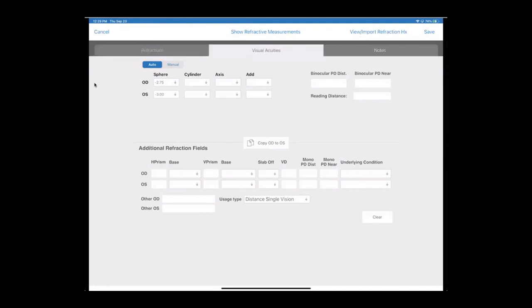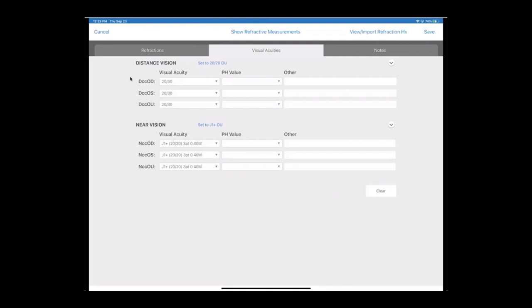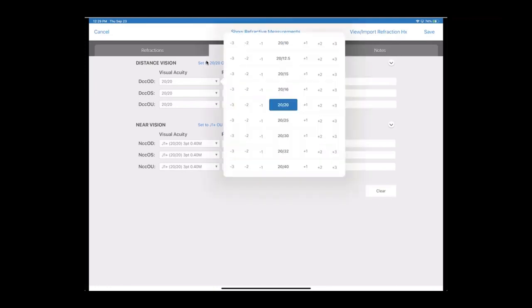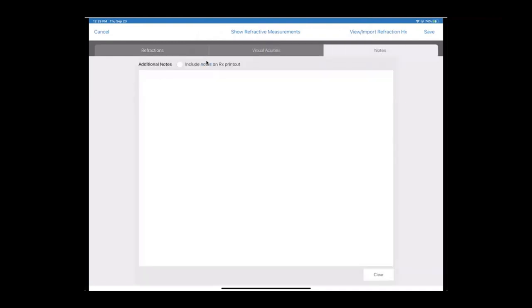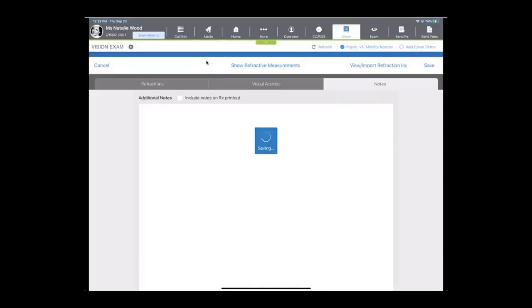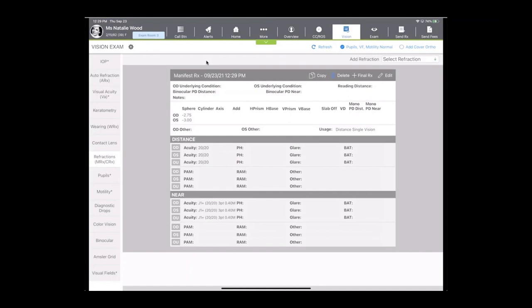Then you go right into the visual acuities tab. If everything looks good, you can use the nice little set as 20/20 buttons that we have in blue, or use a drop down and make your selection. You can leave any notes for yourself or to be included on the printout, and then save.